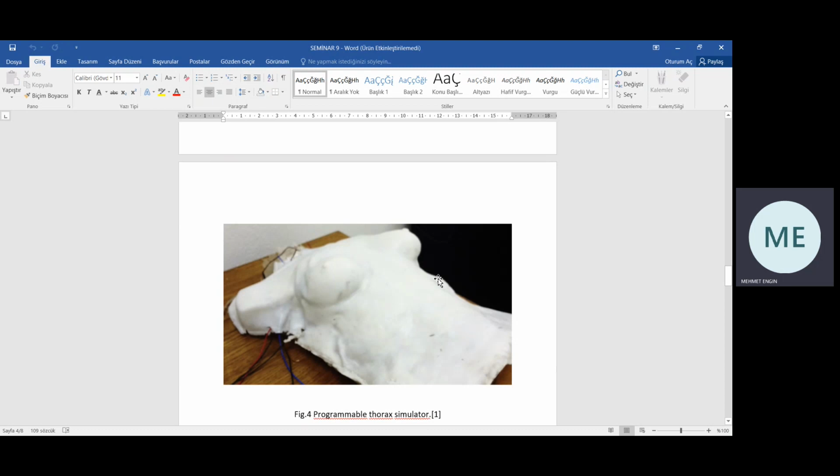The hydrogel of polyvinyl alcohol, or PVA, polymerized with sodium borate, was poured into the area corresponding to mammary tissue, simulating the mammary fat pad. Thermal actuators were included inside the hydrogel to generate temperature gradients when they are energized for breast thermal abnormality simulations.